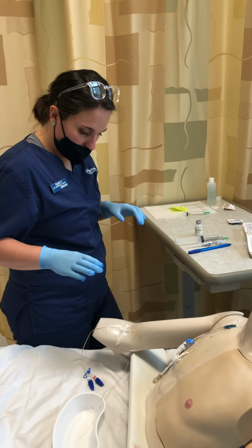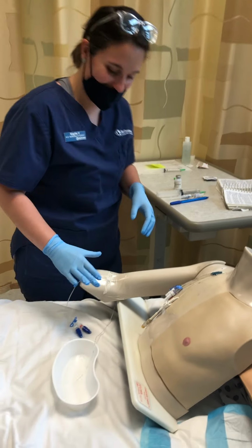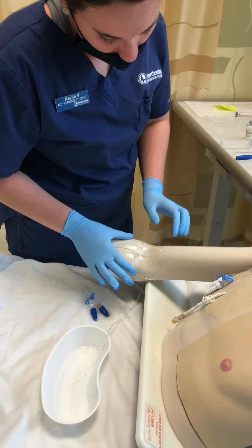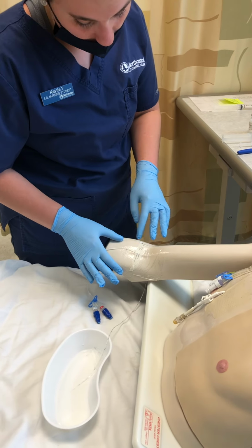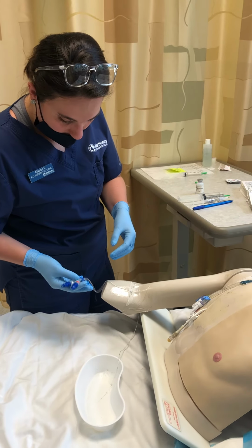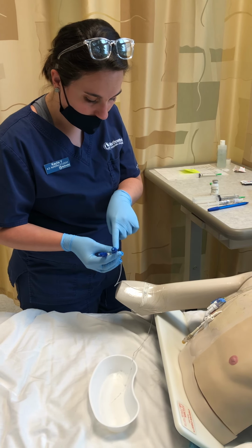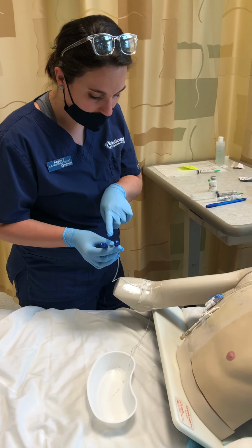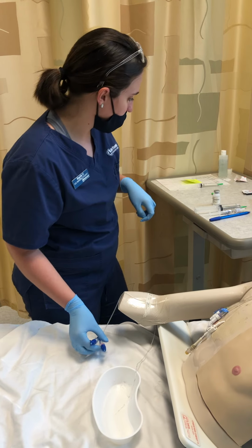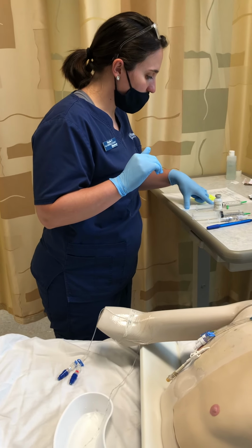And before I administer the medication, I'm going to take a look at his PICC site. I'm checking the area for redness. I see no redness, ecchymosis, edema, or drainage. It all looks good. And I know that I'm going to be giving the medication via the red port because I checked the chart and that is the port that's dedicated to medications. So the first thing I'm going to do is get my rights out of the way.